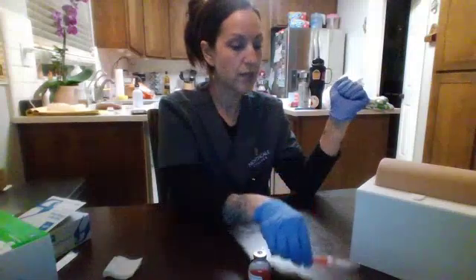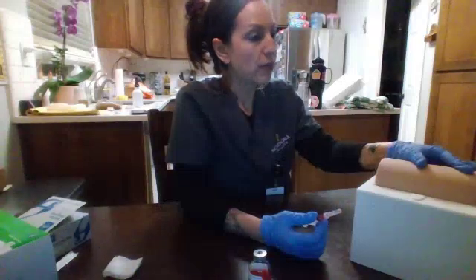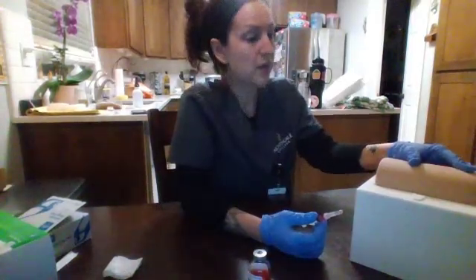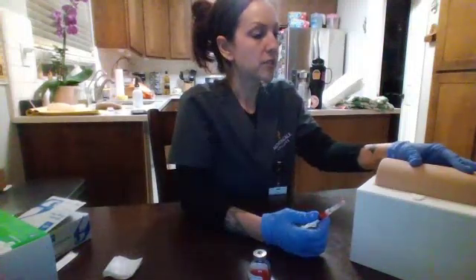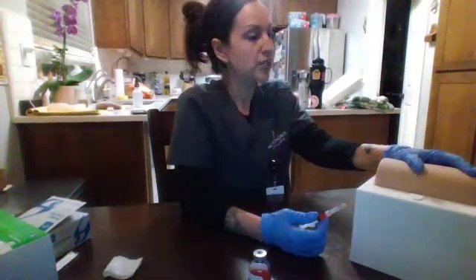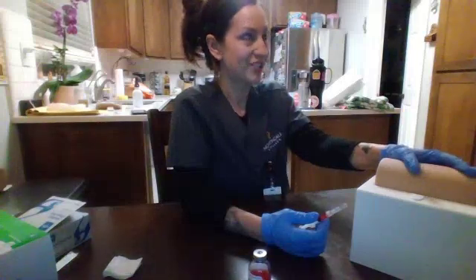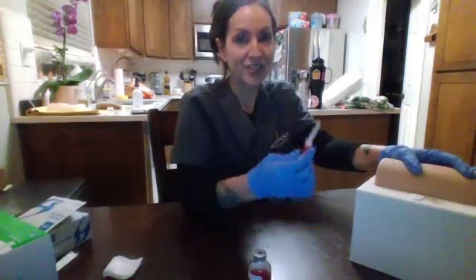Once that is dry, I'm going to take my non-dominant hand and either gently pull the skin tight or slightly grasp the muscle to increase the muscle mass. I'm also going to position my ulnar side and hold the position just below and hold it there until injected.